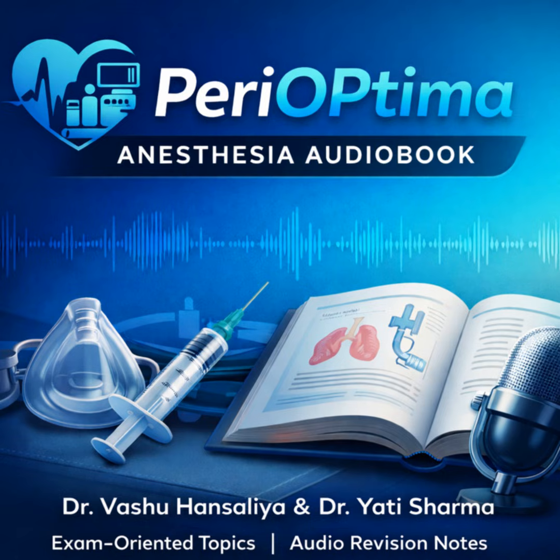That's a critical threshold. And if you get a grade 3 view? If you get a grade 3 view, you must abandon the attempt with that device. You immediately switch to an alternative plan, a bougie, a video laryngoscope, something different. The grade you achieve dictates your next move.